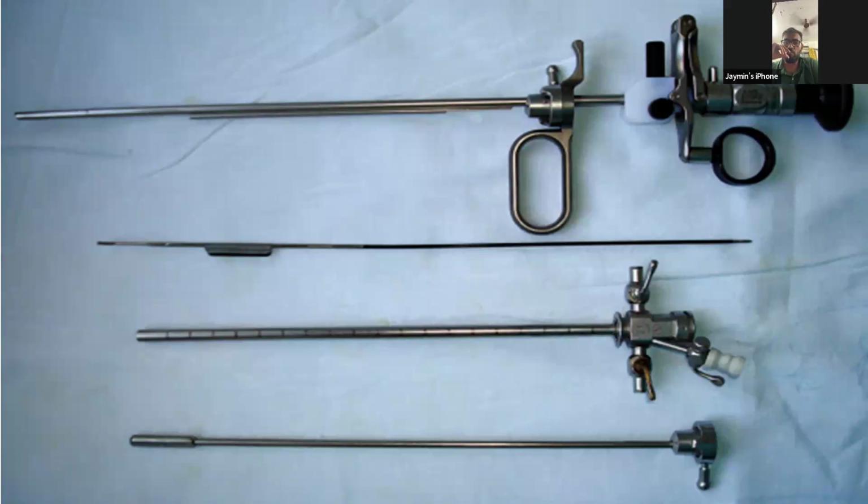When we push the thumb, the blade comes out. That is the biggest advantage. If it is used for another procedure like a TURP, the loop remains inside the sheath. Whereas in the active one, it is finger operated, so it generally stays outside, and when we pull it, then it comes in. That is the main difference between passive and active.